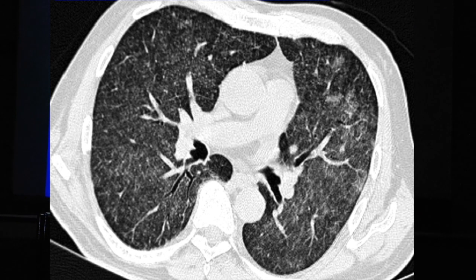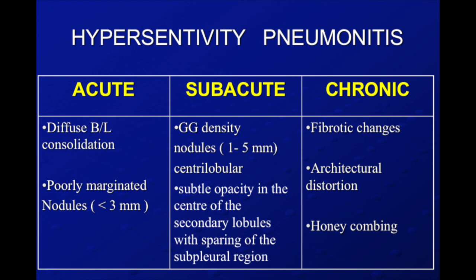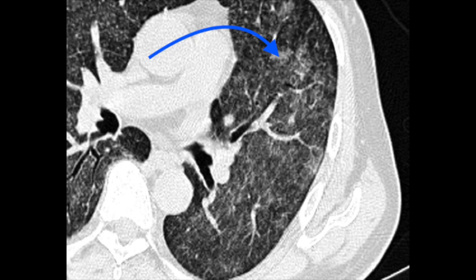What is your diagnosis? Do you think it is subacute HP? Yes — hypersensitivity pneumonitis. Now, not many times do you image acute HP. Most of the time you image subacute HP. These are centrilobular nodules scattered in bilateral lobes, and most of them are more in the upper lobes, but they are also seen in the lower lobes.